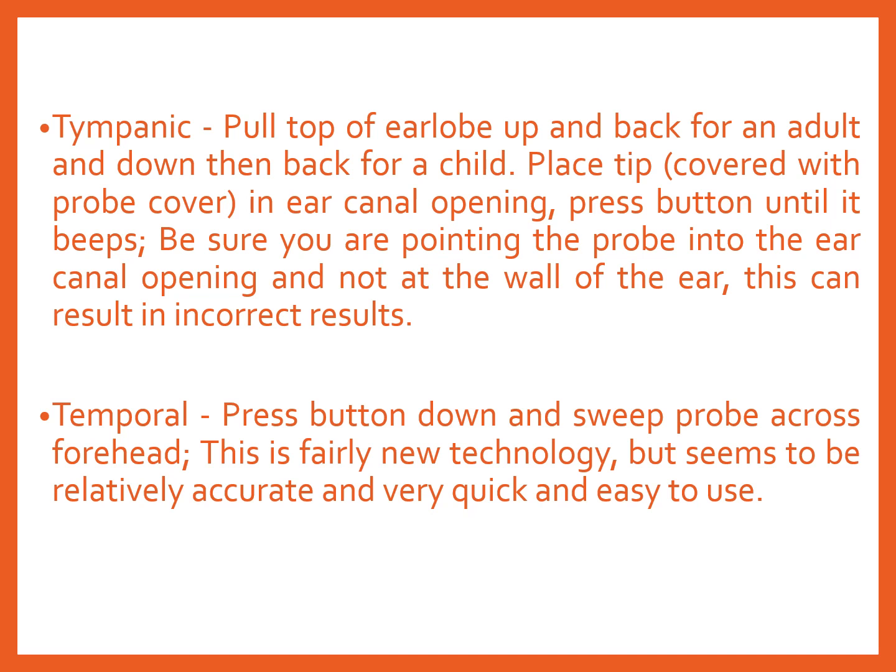For the temporal, press the button down and sweep the probe across the forehead. This is a fairly new technology, but it seems to be relatively accurate and very quick and easy to use. Because of this pandemic, we've been using the temporal infrared thermometer; when we go to the malls or other establishments, our temperature is checked using the infrared thermometer.